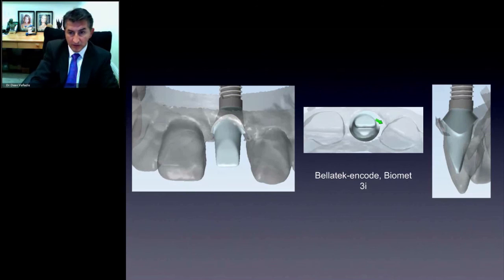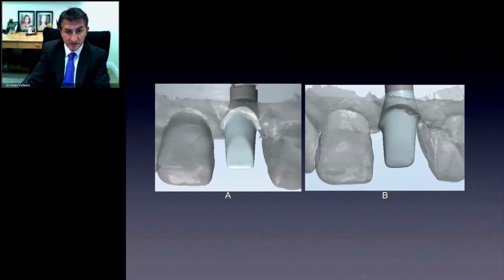Look at the angle that is created here. Look at this angle. And you can imagine that this angle could be short or it could be wide. That's going to change the tissue level. So when I get these back from the PSR facility, I consistently check these. So this is their design, and this is my design.